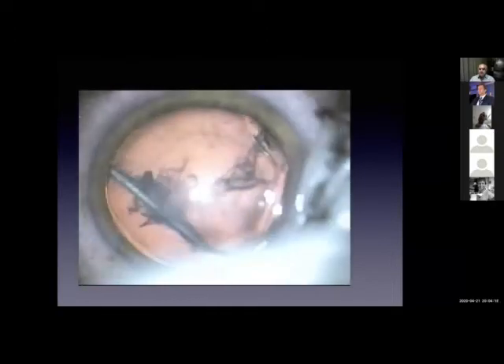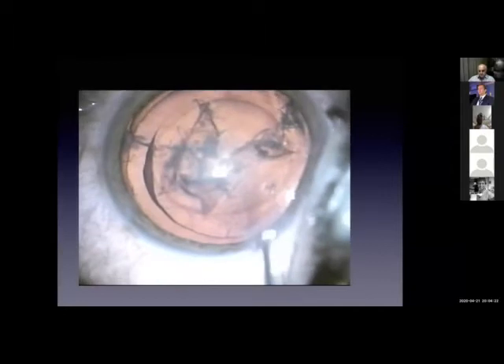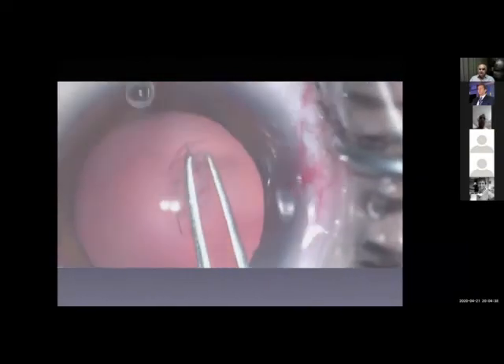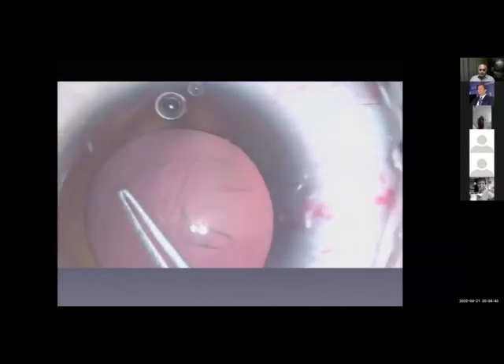This is hydrodissection, and then you start hydrating the nucleus. A proper capsulorhexis is essential. The same technique can be applied in pediatric cataract surgery, because it's a soft cataract as well. Give time to do a proper capsulorhexis. Then you do hydrodissection, hydration — as if you're doing hydrodelineation, but you hydrate all the nucleus.